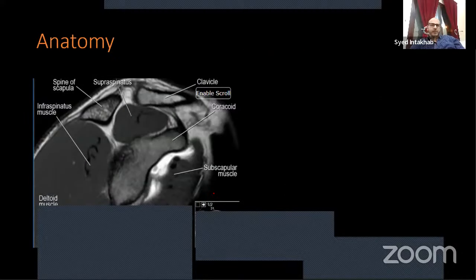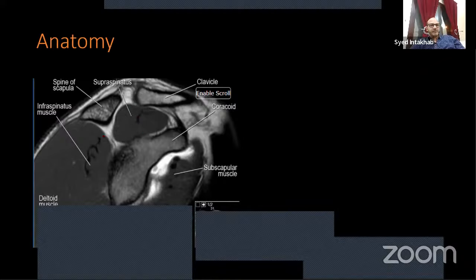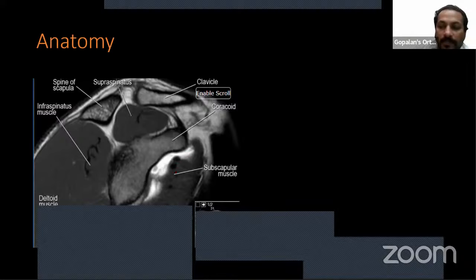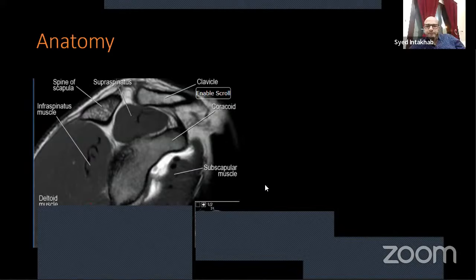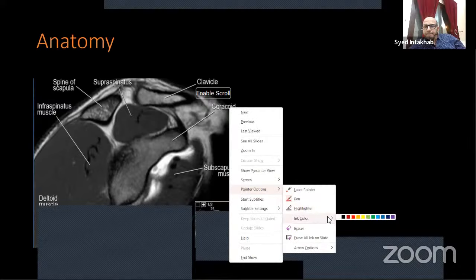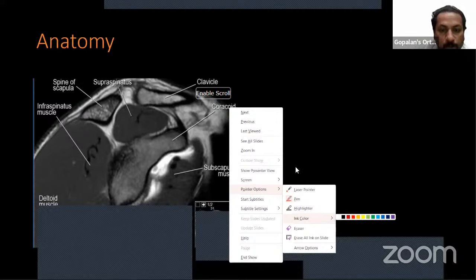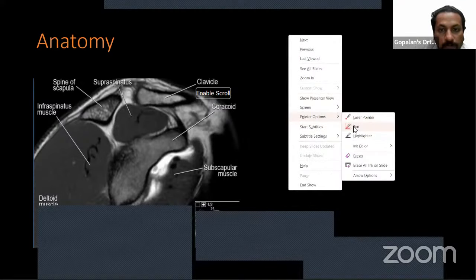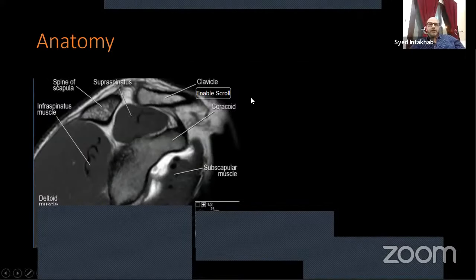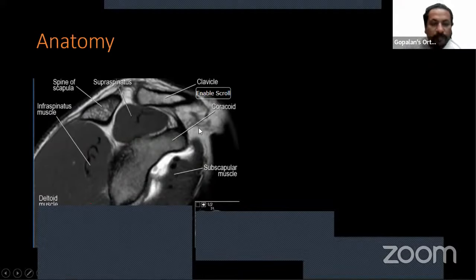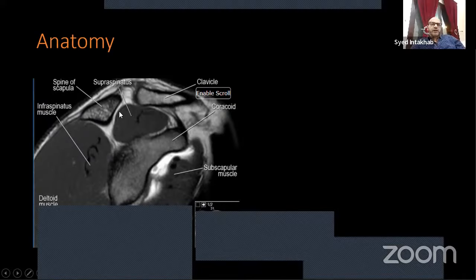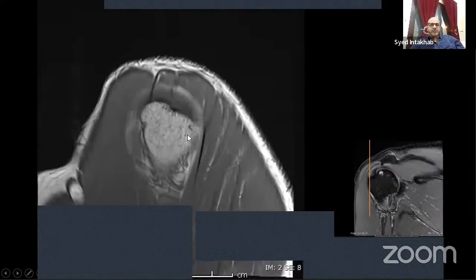The most important part in MSK radiology is anatomy — if I know anatomy, I will know pathology. This is the spine of scapula, meaning we are posterior. This is the coracoid, glenoid, and the supraspinatus muscle. Here is the infraspinatus and teres minor. The supraspinatus, clavicle, spine of scapula, and coracoid are all visible on this sagittal cut.